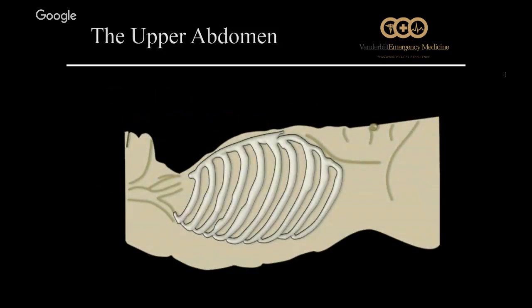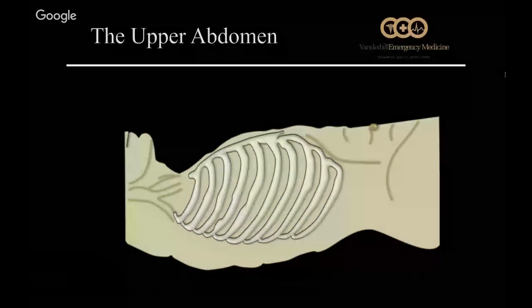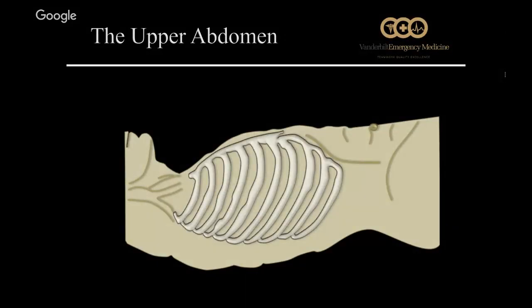So now we're going to move down into the pelvis. We're going to have the probe right at the midline with probe marker up towards the head. I really find it pretty crucial to perform this portion of the exam in sagittal. I was taught initially both transverse and sagittal were interchangeable, but I find that the sagittal just gives me a much better clarification of the surrounding anatomy and much more clarification on my diagnosis.